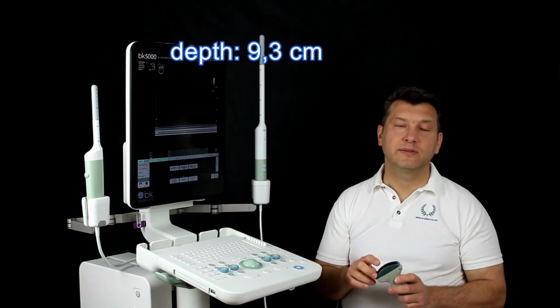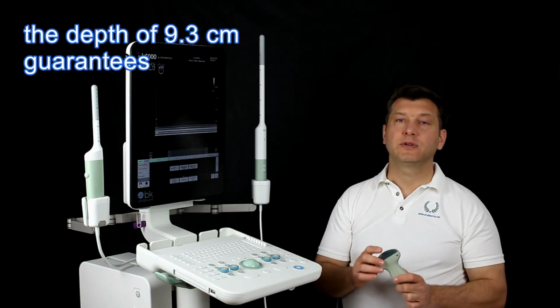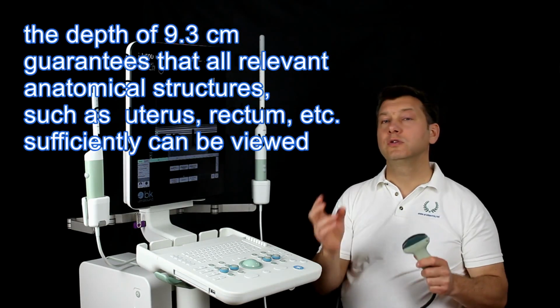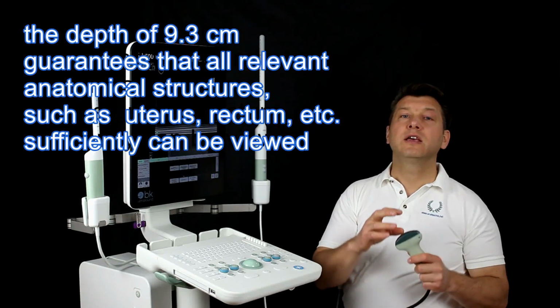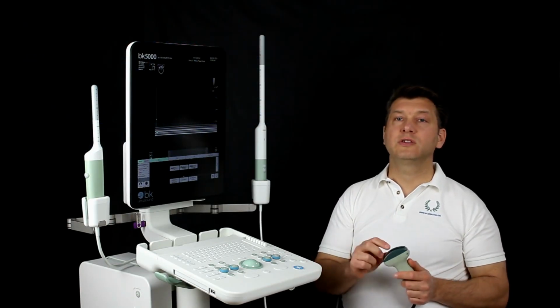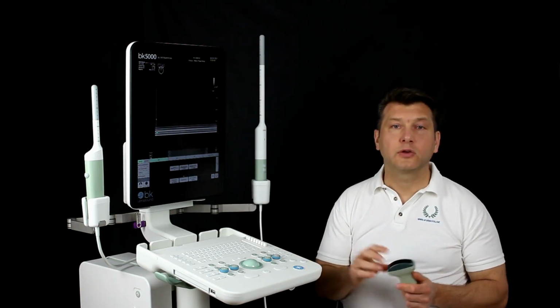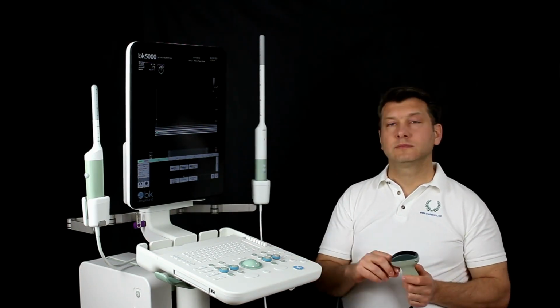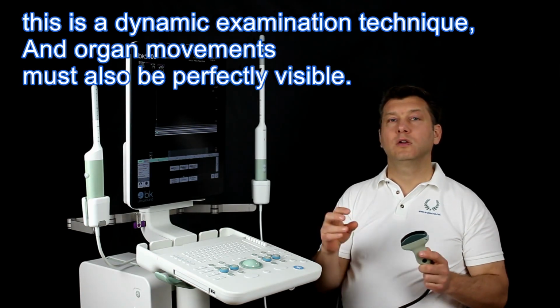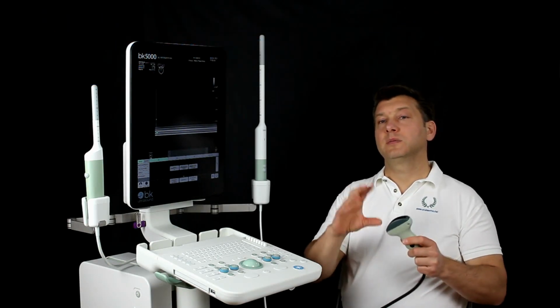Depth 9.3 cm. The depth of 9.3 cm guarantees that all relevant anatomical structures such as uterus, rectum, etc. can be sufficiently viewed. With a low penetration depth, for example 3 cm, only organ parts can be assessed. This is a dynamic examination technique and organ movements must also be perfectly visible. This, of course, takes some space.